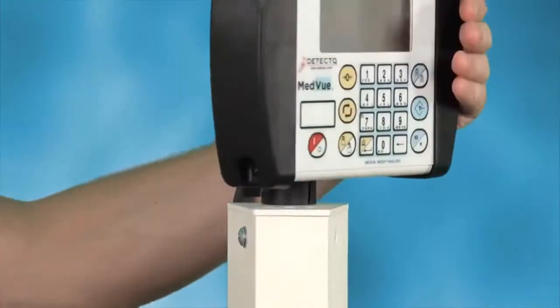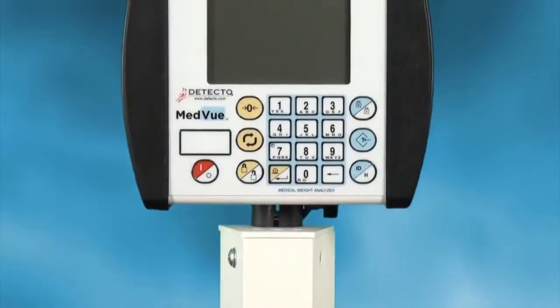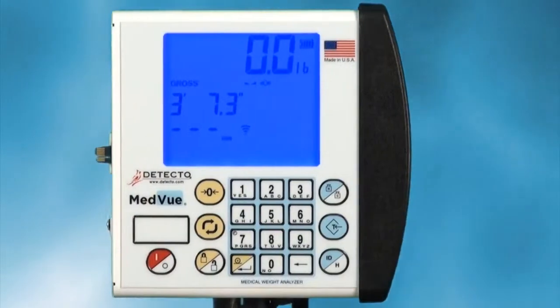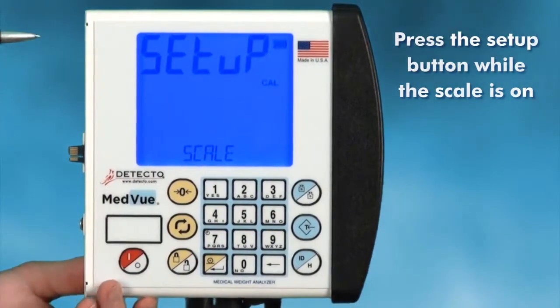Before operation, you must first calibrate the indicator to the scale. To do this, you must remove the left end cap by loosening its two screws. Once exposed, press the setup button while the scale is on to access the setup menu.